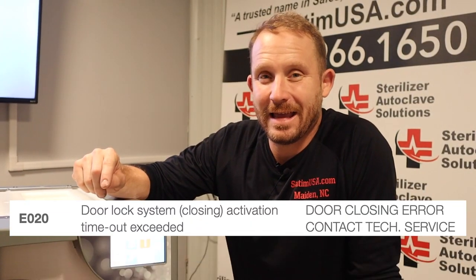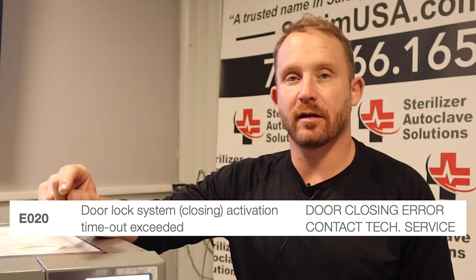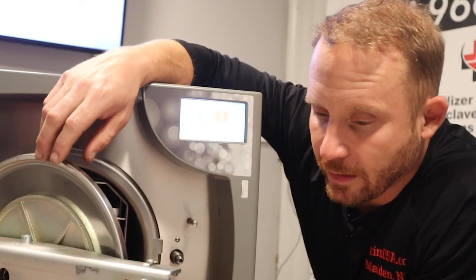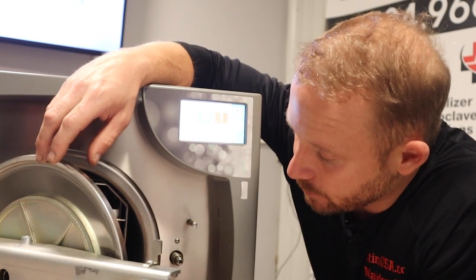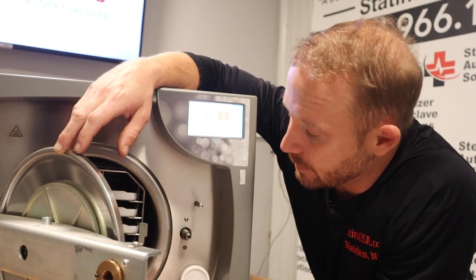Right now, we're going to talk about E020 — door lock system gear motor failure. When getting error code E020, it has something to do with the door locking mechanism.